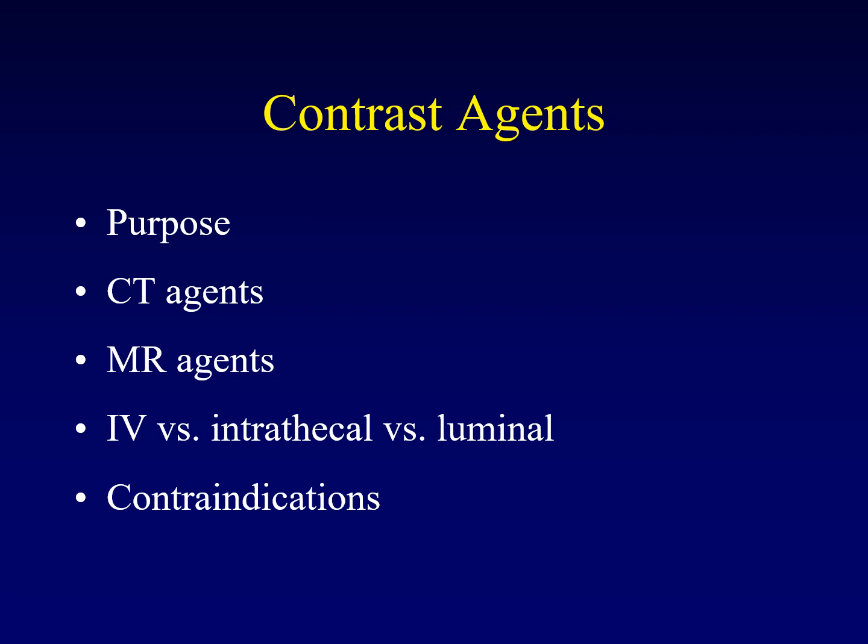In the setting of neuroradiology, there's another really important effect. That's the blood-brain barrier. The blood-brain barrier is the endothelial lining around the blood vessels that prevents things in the bloodstream from leaking out into the brain. A normal blood vessel will keep contrast agents in the bloodstream and out of the brain parenchyma. But an abnormal vessel, like a vessel in a tumor, for example, or a vessel that has been compromised by inflammation, will allow that contrast agent to leak out, and that leakage is something that we can detect.